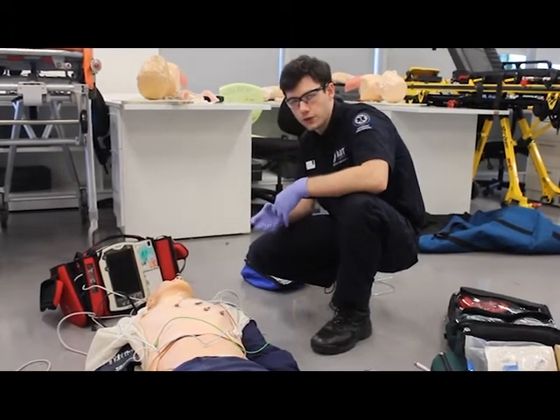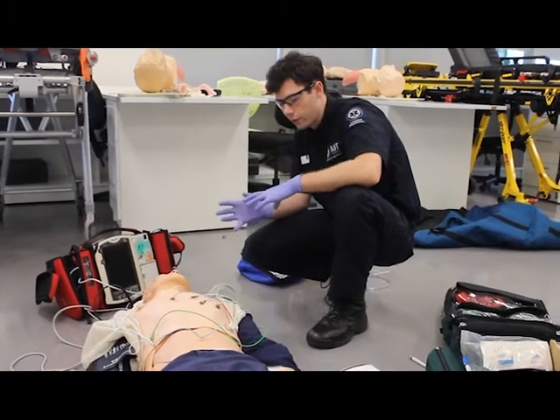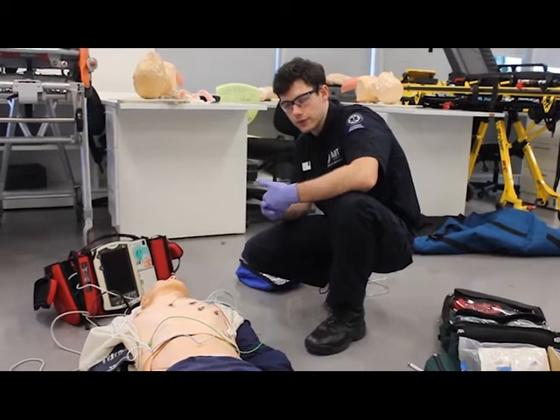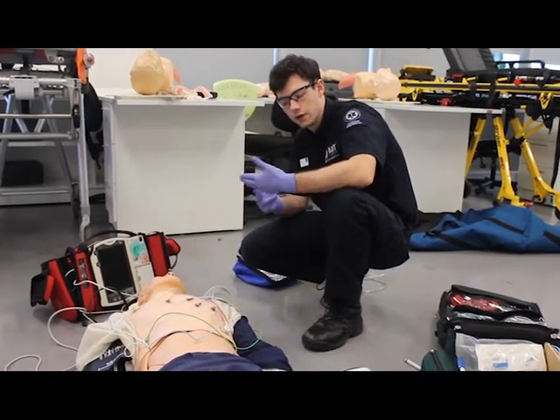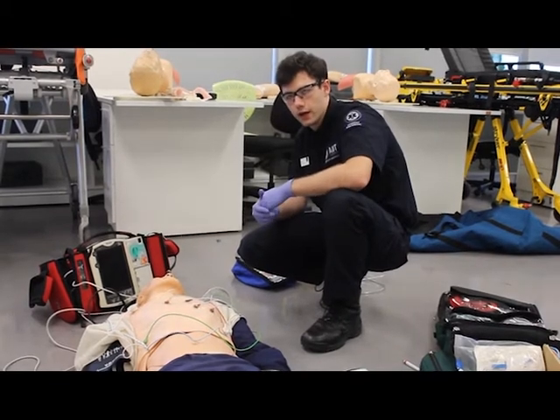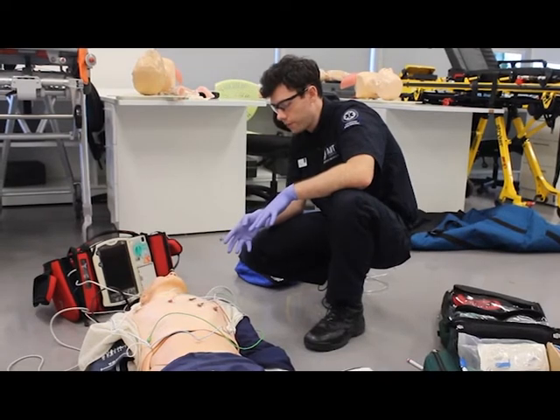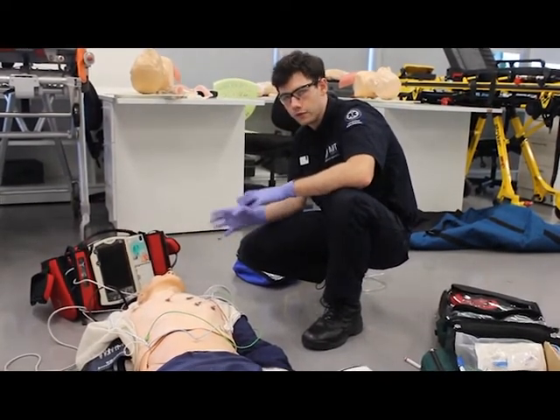We're going to do a focused assessment of Bob, ABCs, and a full set of vital signs. Upon doing this, we've found that Bob's got a heart rate of 170, a blood pressure of 70/40, a respiratory rate of 18, temp 37, and a BGL of 7.6. We've put a 12 lead on Bob and a 3 lead, and we've found that Bob's in VT.